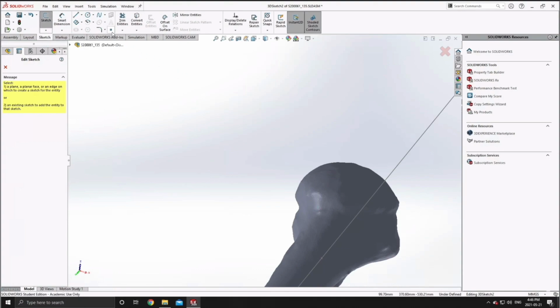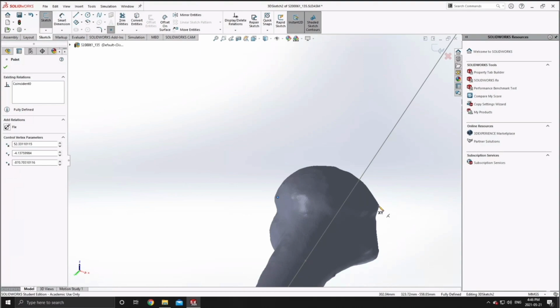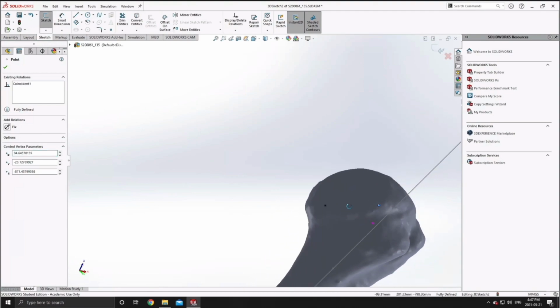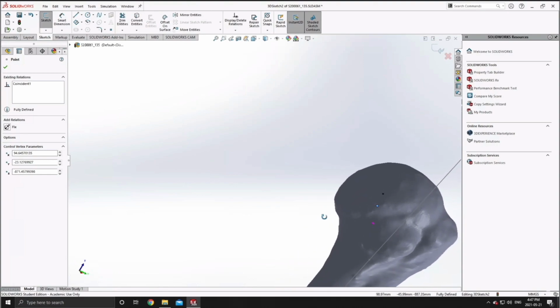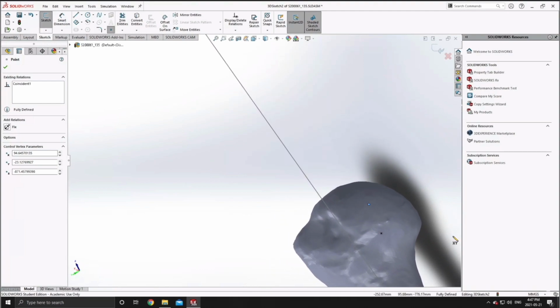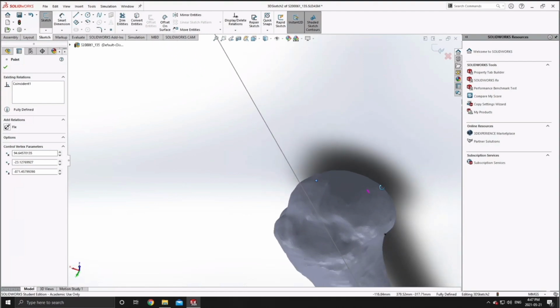Now, moving right along here, we're going to have to isolate 3 points at the utmost ridge of the humeral head, so directly adjacent to the anatomical neck. Now, this will provide us with the direction of the retroversion, or the degree of the retroversion of the resection cut. And this is probably the least analytical portion, as we're isolating based on the bony anatomy in this region where we assume the humeral head to be.